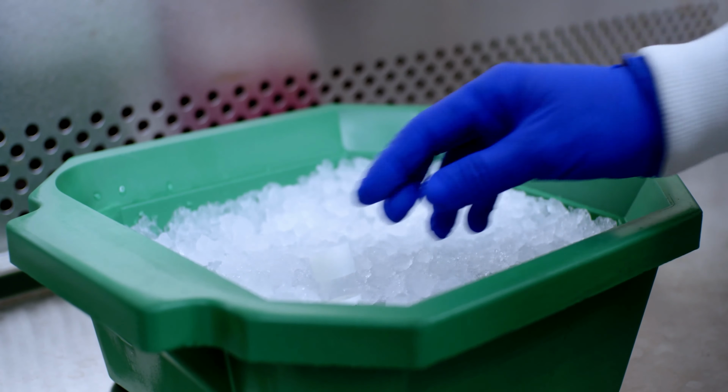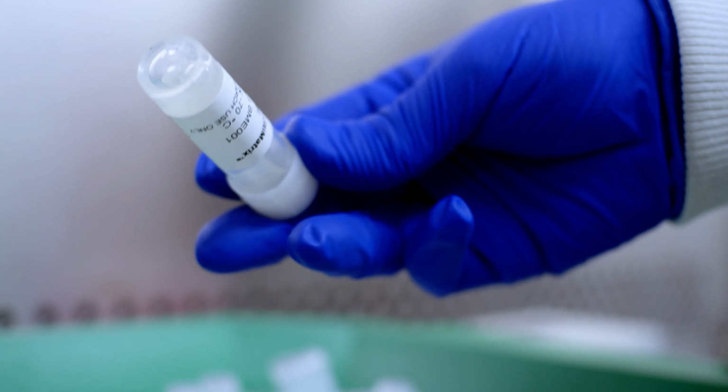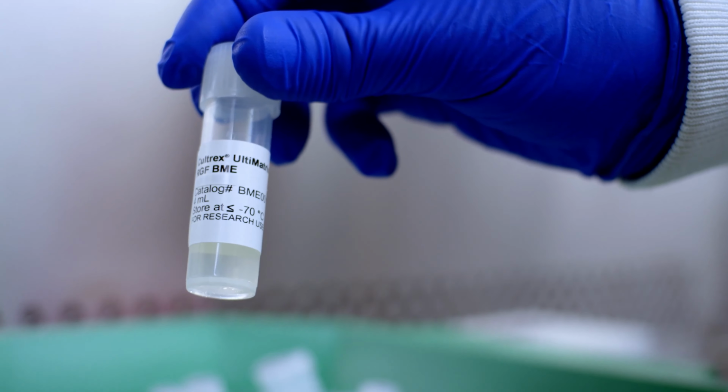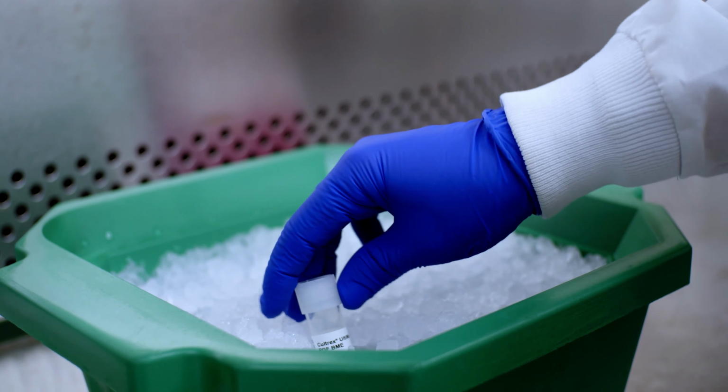The next morning, remove the matrix from the refrigerator while keeping it on ice. Gently swirl the matrix on ice to ensure a homogeneous mixture before aliquoting or downstream use.